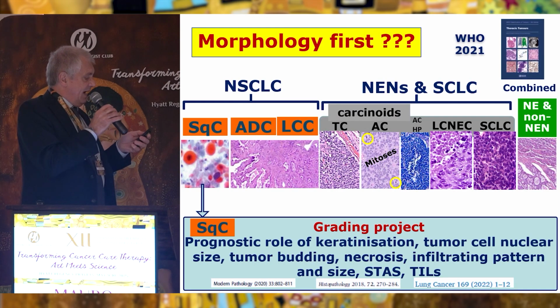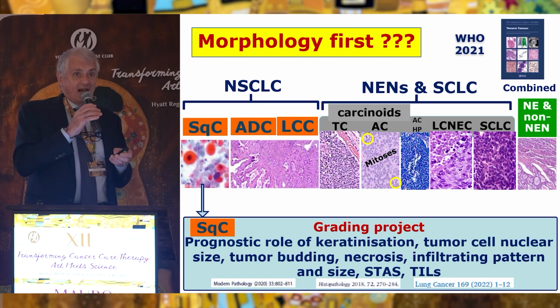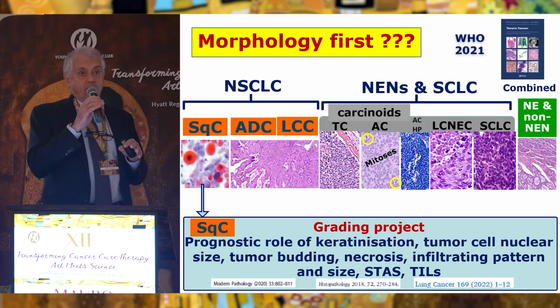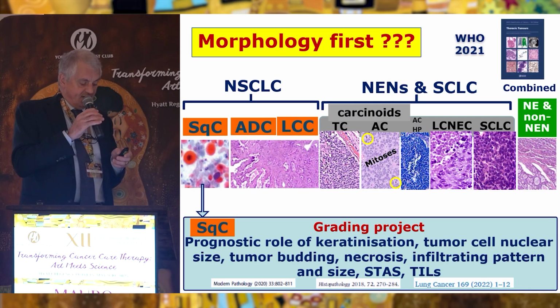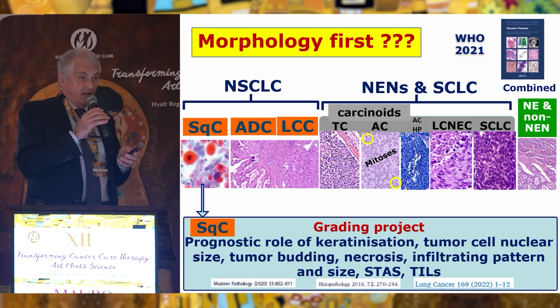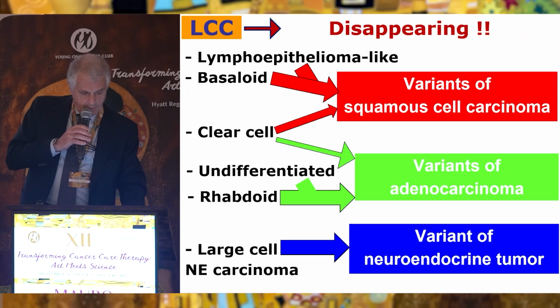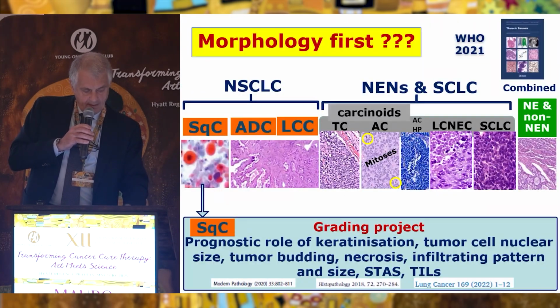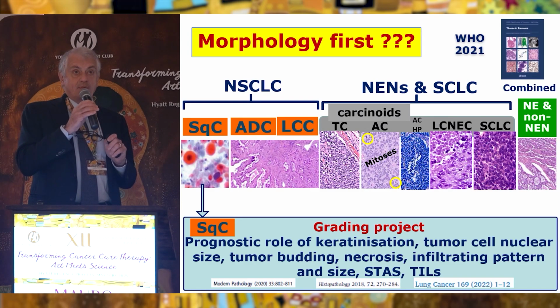So for the time, we have to use the microscope and try to provide the name and possibly the surname or possibly the nickname of different lung cancers according to the WHO classification, which is listed in this slide, including non-small cell lung cancers on the one side and neuroendocrine tumors on the other. These things have not changed. The names have not changed.